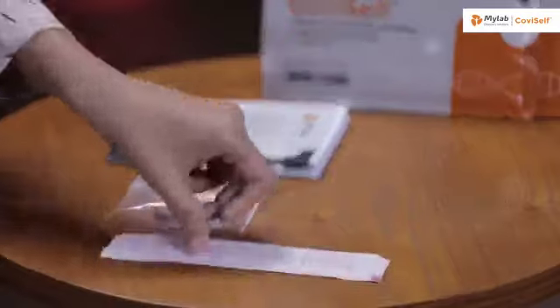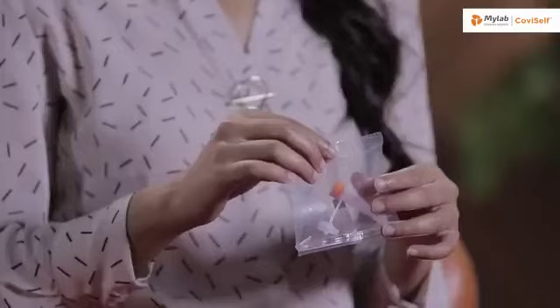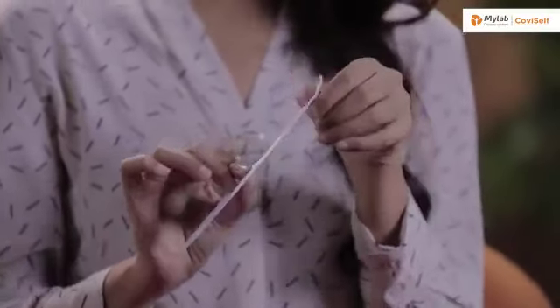Lay the contents of the kit on a table and I will walk you through them one by one. This is the instruction manual. This is a pre-filled extraction tube. This is a sterile nasal swab. As you can see, it has two sides — one is the plastic side and the other one is the paper side. One test card. This is a biohazard bag.